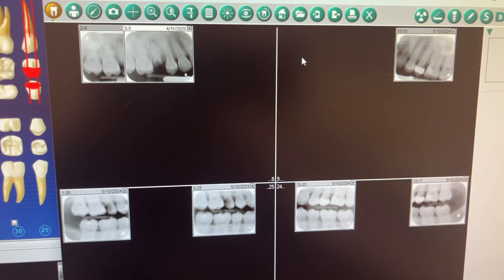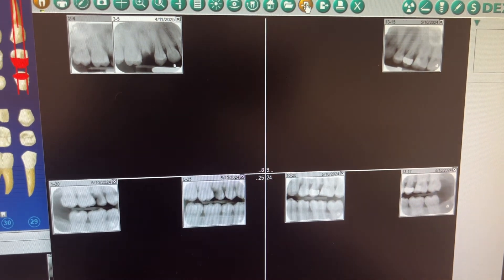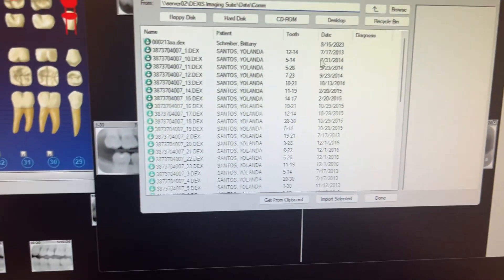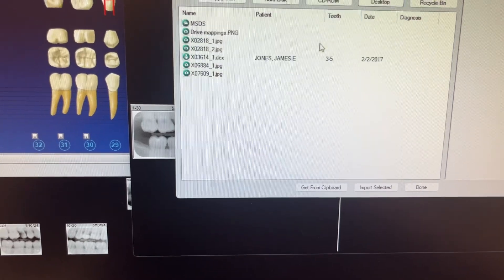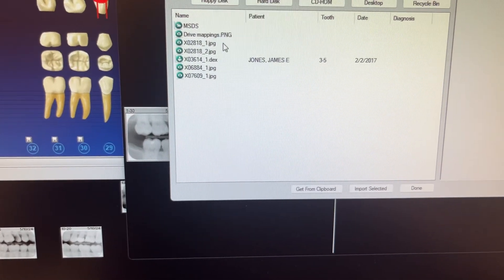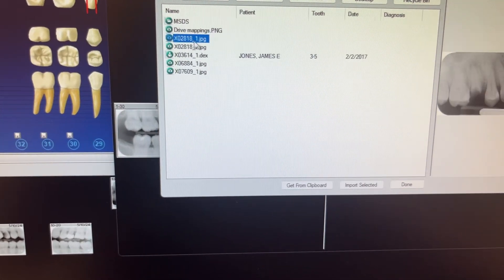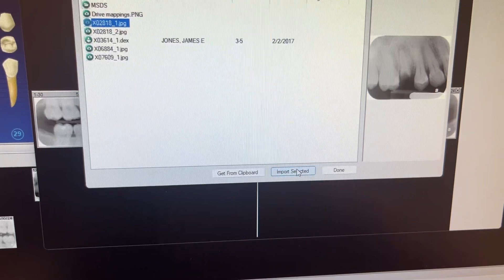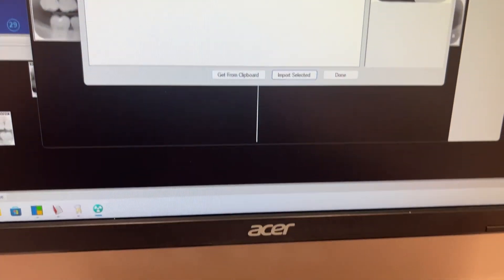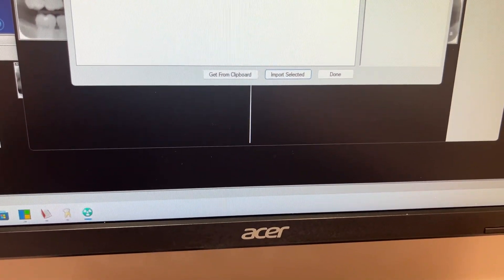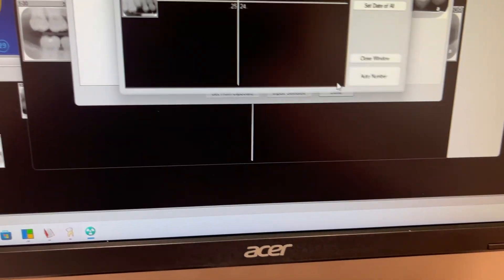And then you're going to go up here to import. And you're going to go to desktop where you imported the image. You're going to click on the image that you imported. That was the image. You're going to import selected. And then you're going to say done.